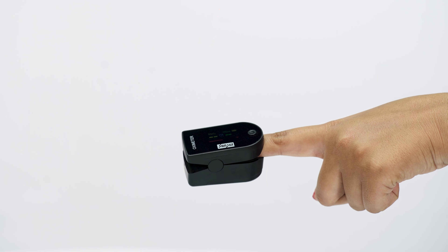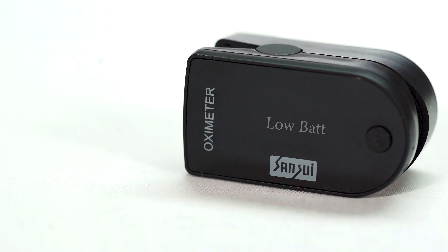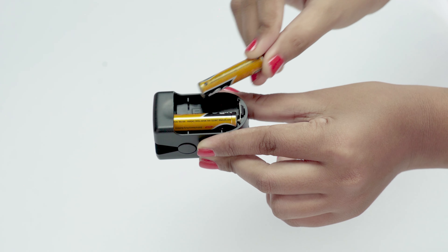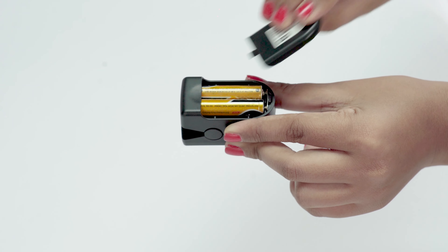Hence, this product is not recommended while the body is in motion. "Low bat" will appear on the display in case battery power is low, prompting the user to replace the two AAA batteries with 1.5V.